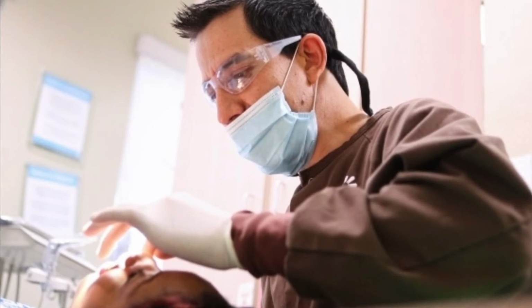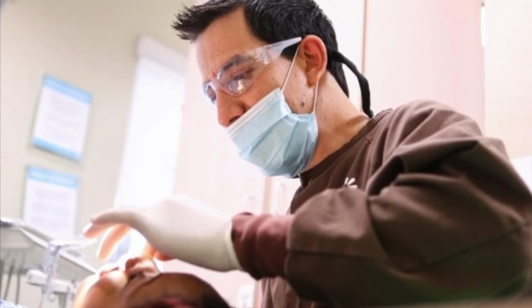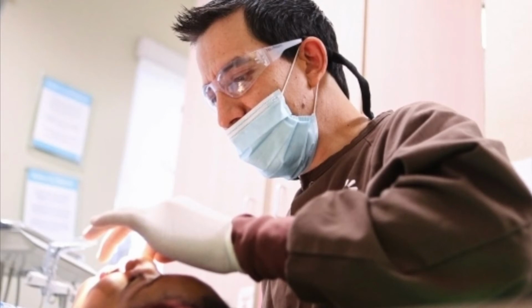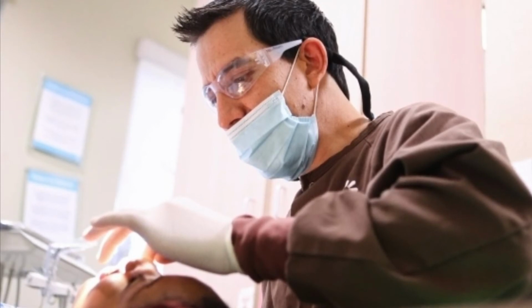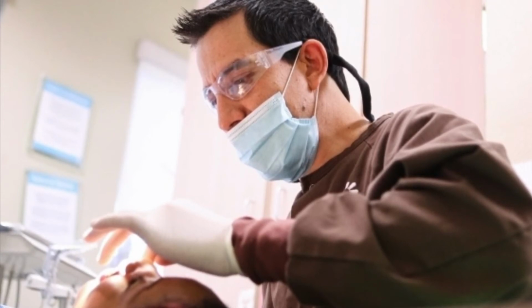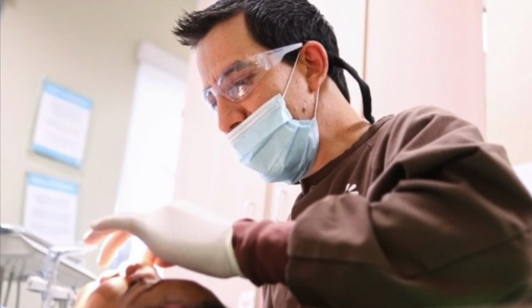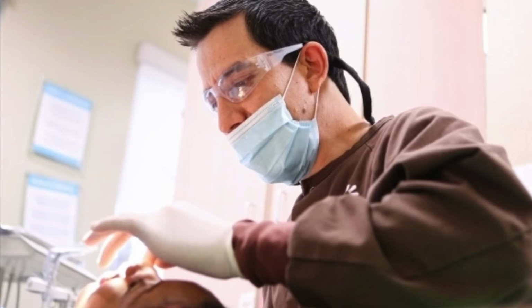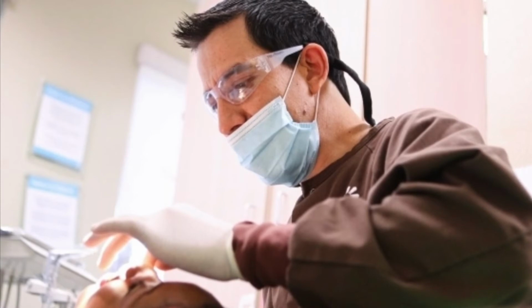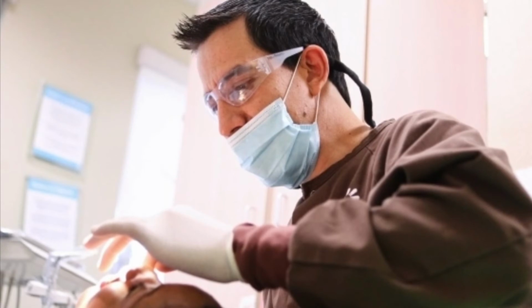Radiographs should be repeated in the following stages of treatment to check the working length, to see if it was right or not.